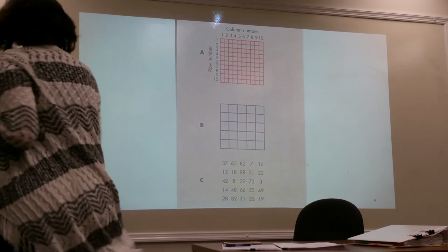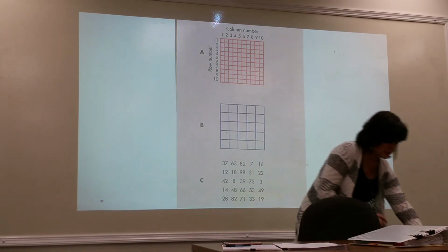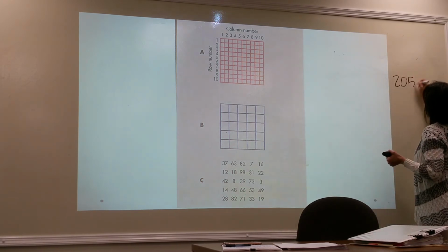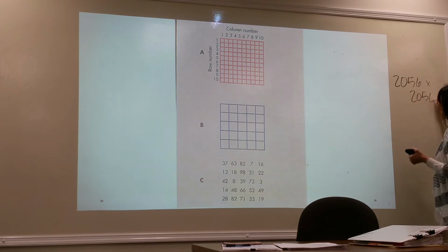Again, they come in different sizes, of course. Versus, what did I say? This is an increase in pixel size, right? You get more pixels, okay? This is a smaller size. So does this one have more pixel size compared to the other one?